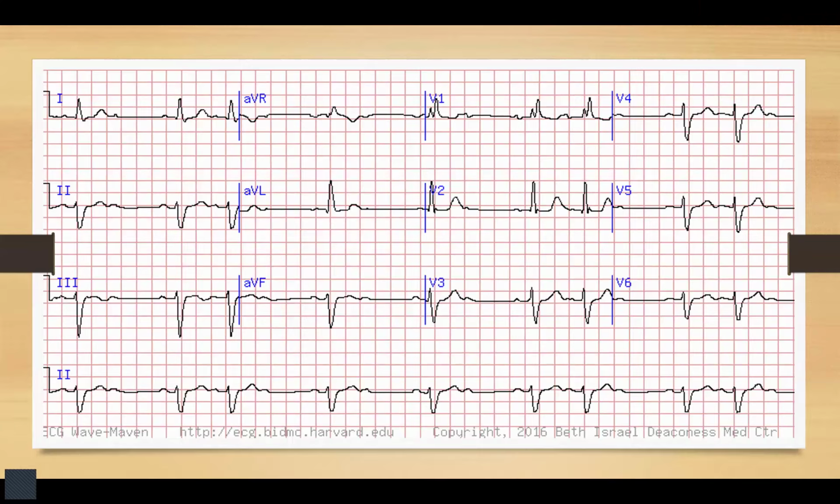All right. So she got here by saying she felt short of breath, she didn't feel particularly well, right? So even though we have this kind of group beating that is a little distracting, we'd still want to make sure she doesn't have any ischemia, right? So we're going to look in all of our leads. I'm actually not particularly fond of that ST segment in V2, right? That looks like it has a little bit of scooping there that probably shouldn't be there, right?